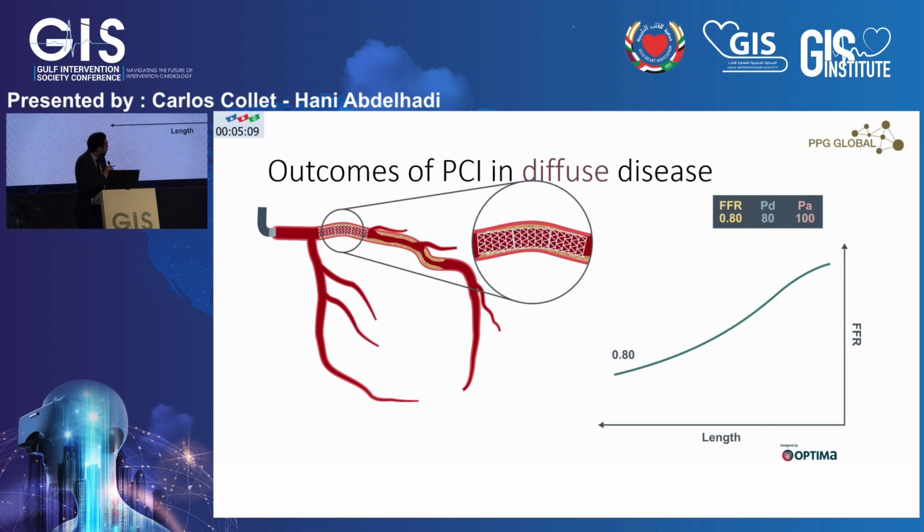Any comment from your side, in terms of what was done in the cath lab, and again, the whole theoretical rationale behind it? I think the first thing is we saw the disease in the first case with this LAD disease, but we didn't really think it was that significant. Not enough to cause the presentation that came in, but sometimes the angiogram fools you, right?